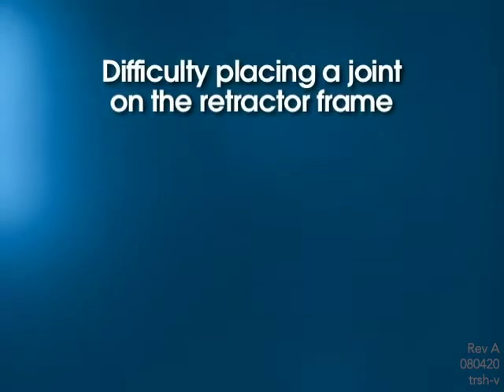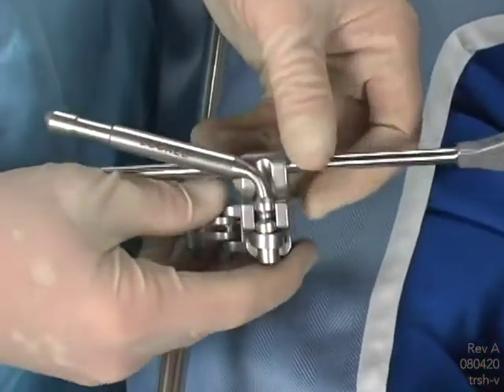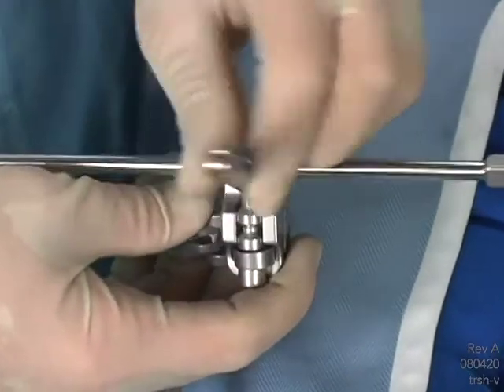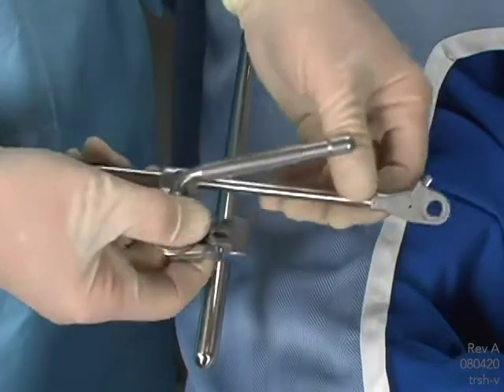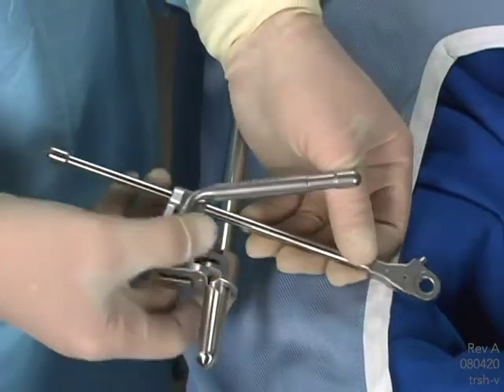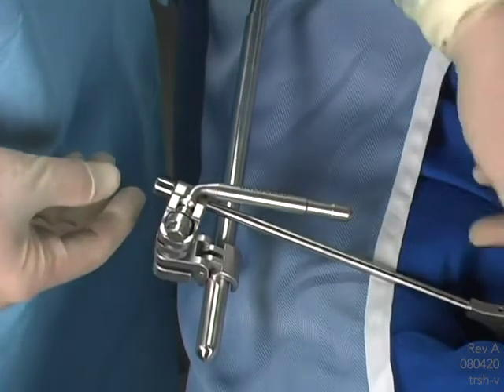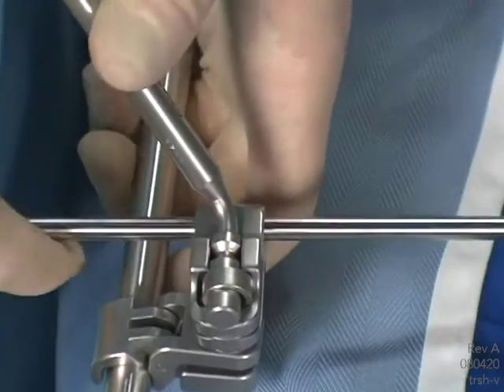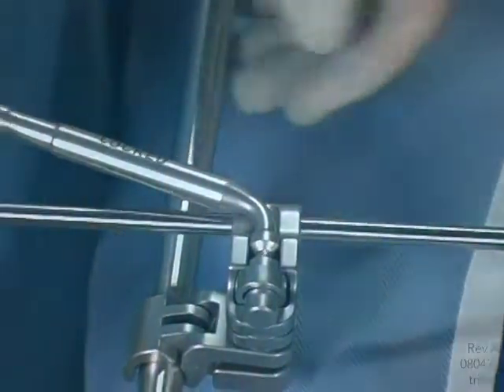Difficulty placing a joint on the retractor frame. If you find it difficult to place a cam joint onto the frame, make sure the words "unlocked" on the cam joint handle are facing up. With the handle in the unlocked position, snap the joint onto the frame. You can leave the joint in the unlocked position as it will not fall off. When ready, lock. In the locked position, the words "locked" will be showing.